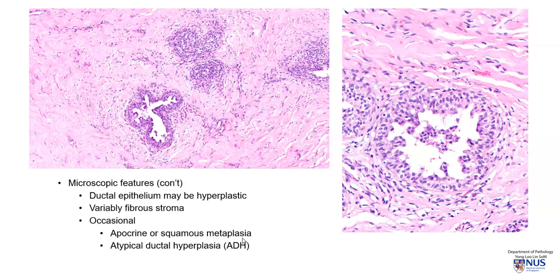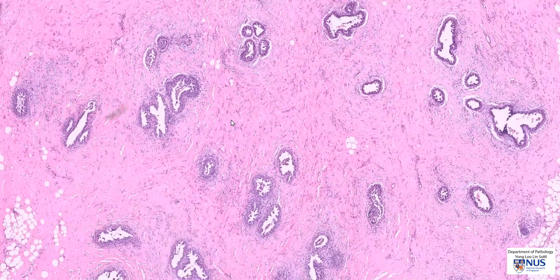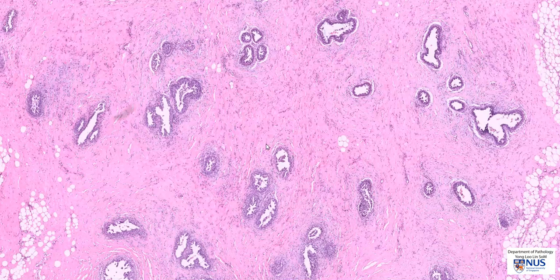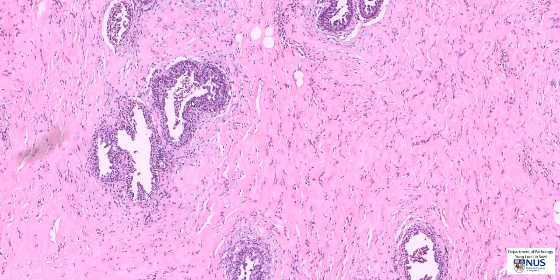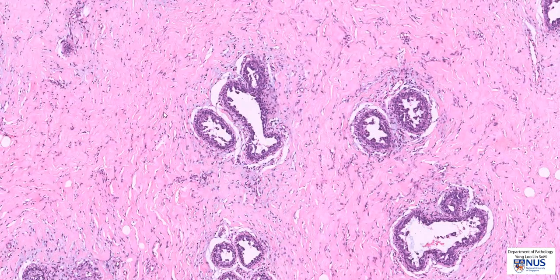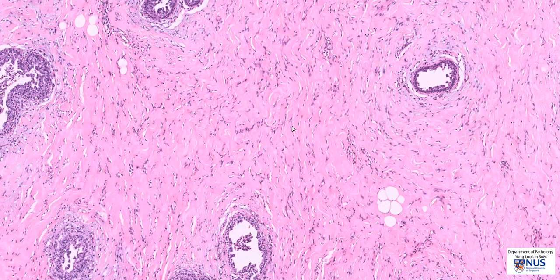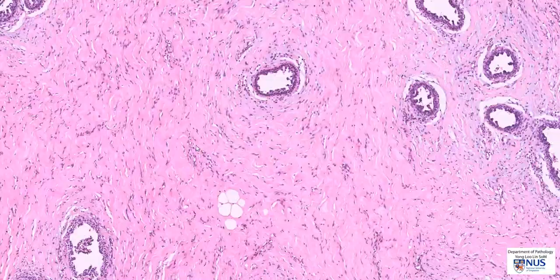Occasionally there can be apocrine or squamous metaplasia as well, and even atypical ductal hyperplasia, which may give rise to increased risk of developing breast carcinoma. In summary, this is an example of gynecomastia where we have increased numbers of ducts not accompanied by lobules, showing variable degrees of ductal or epithelial hyperplasia, and a collagenous stroma with increased numbers of spindled stromal cells in some areas.